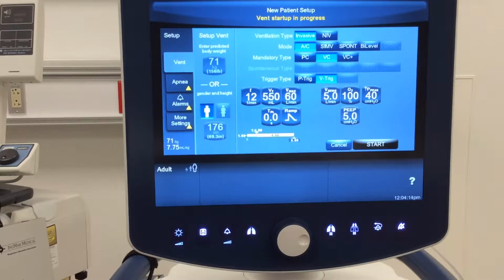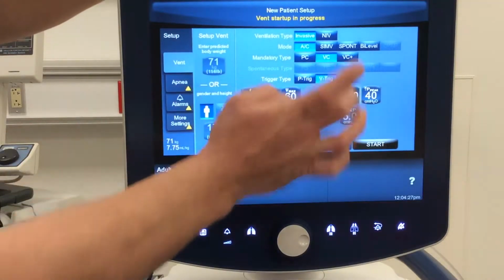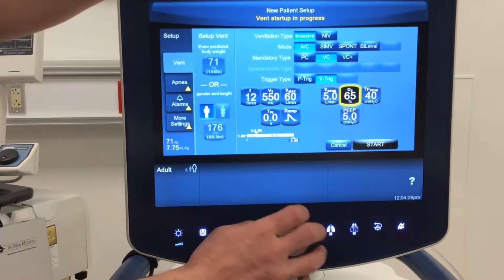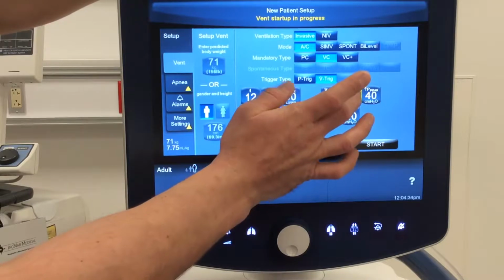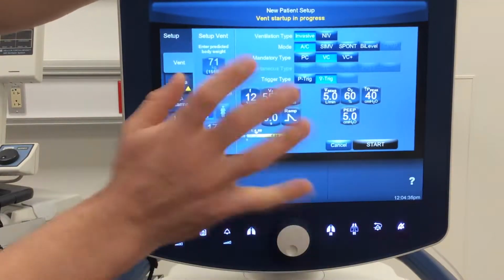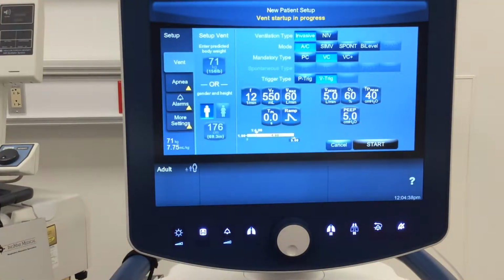Okay, sometimes you have baseline information. So somebody's failing BiPAP, but they're oxygenating okay and they're on 40%. We can carry over. Very rarely do we start somebody on 21% in the adult population. I'm going to do so here today because we don't have a real patient. And actually, never mind, on our little handout here, we got an FiO2 of 60. So we'll practice setting that, but I'm going to have to disable the oxygen analyzer on this, which you would not do in clinical practice.